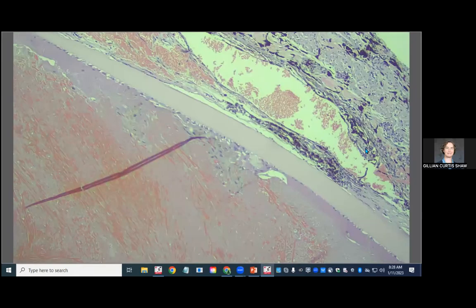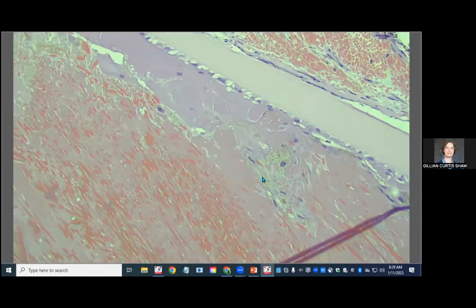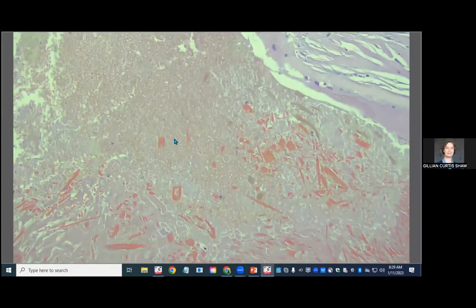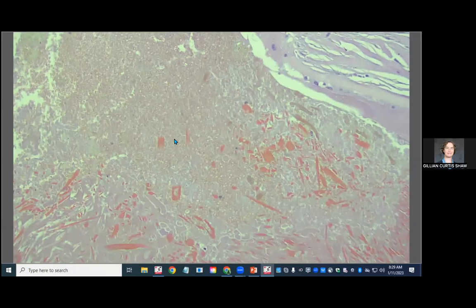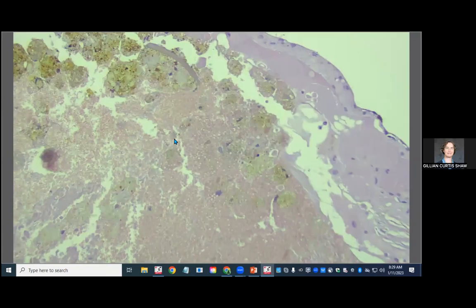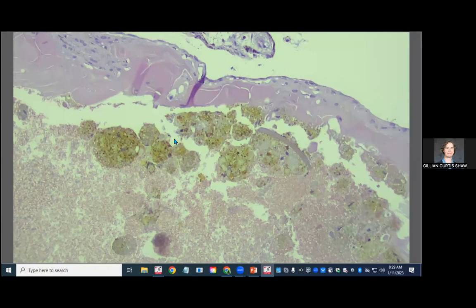And on the edges, we start to see some of our blood pigments coming in, some hemosiderin and hematoidin. There are also some macrophages inside the lens admixing with all this stuff, which implies that somewhere there must be a capsular defect. So we'll go looking for that. Here's some more. There we go. Here's some more hemosiderin and hematoidin, very pretty, probably in macrophages.